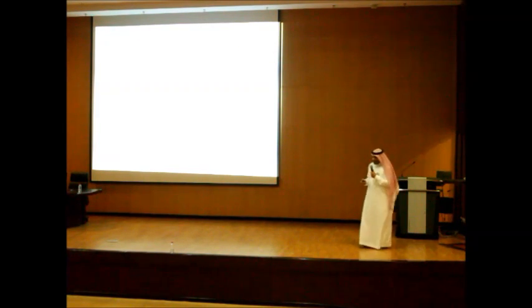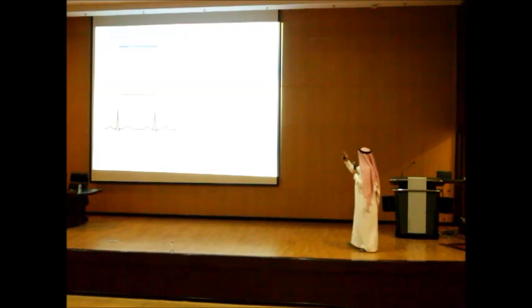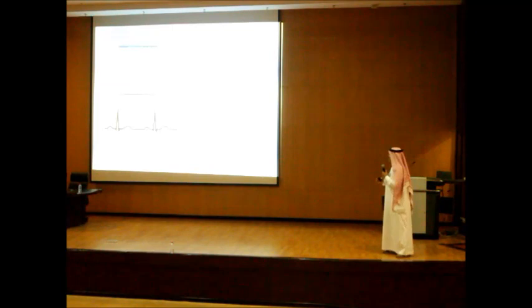Okay. So the first thing when you're reading the ECG, you have to calculate the patient's heart rate. There are three methods. This is number one. You go to two R waves, if the heart rate is regular, and you measure how many large squares are in between those two waves. So in this patient, how many large squares do we have? 1, 2, 3, 4, 5. So 300 divided by 5 is 60. Right, okay, so this is very simple and straightforward. Any questions?